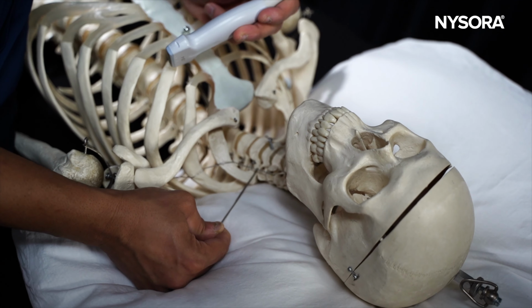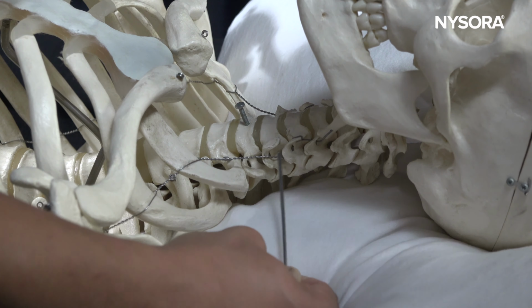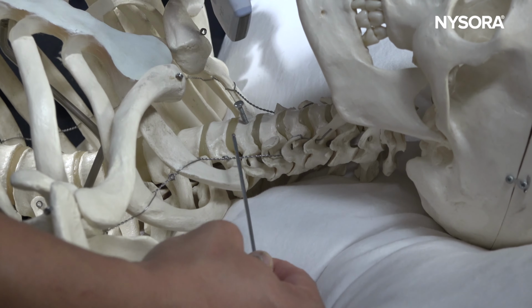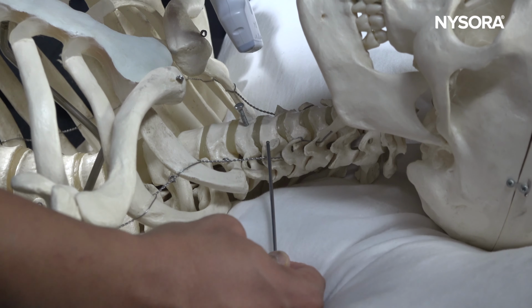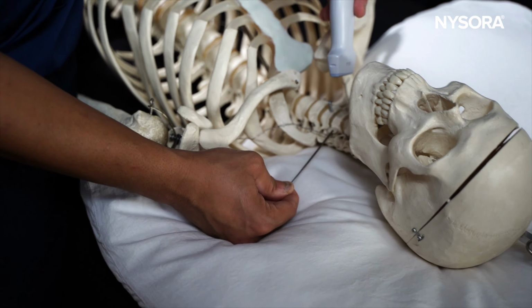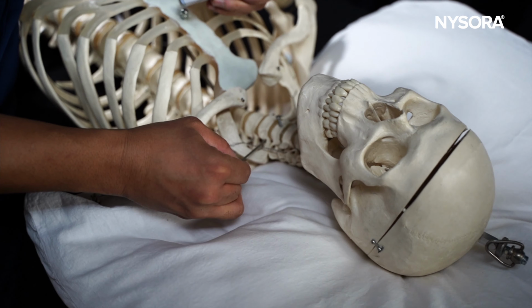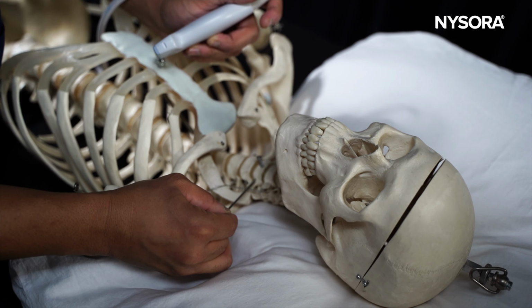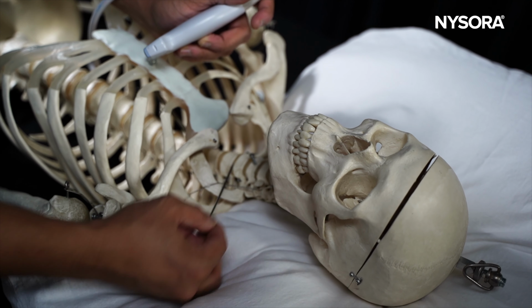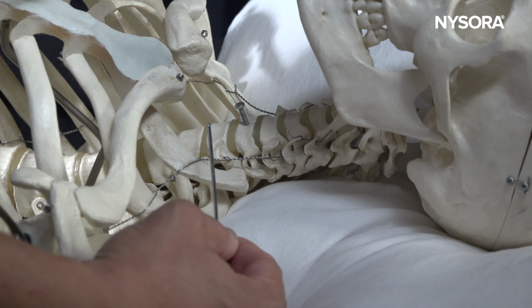And when you're performing the extraforaminal injections, your needle endpoint will be at the posterior tubercle. And when you are performing stellate ganglion block, we usually put the local anesthetic in the middle cervical sympathetic chain and allow the local anesthetic to spread down with gravity, blocking your stellate ganglion, which is situated at C7 T1 level. And that's what you would consider the skeletal anatomy relevant to these two blocks.